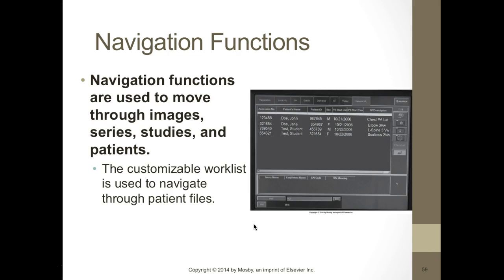So your navigation functions. Use these to move through images. You can go through series, you can go through studies, and patients.